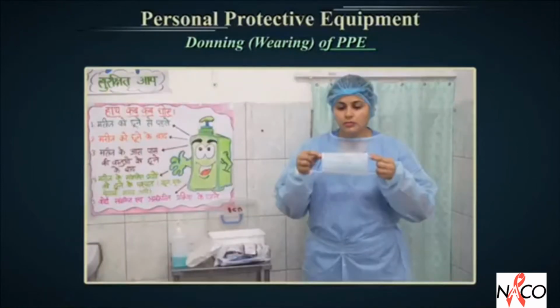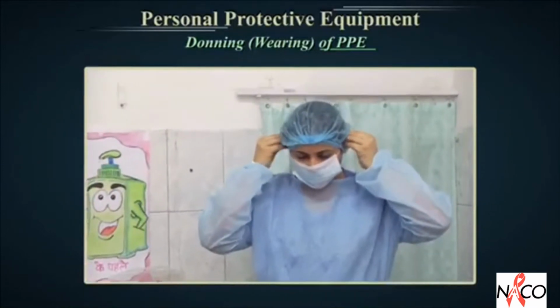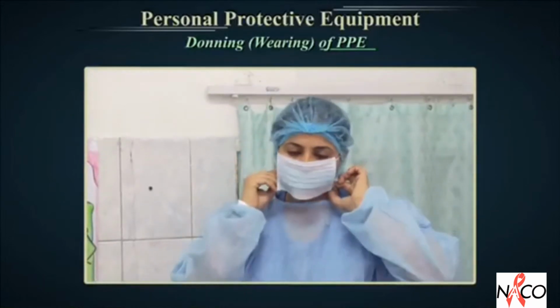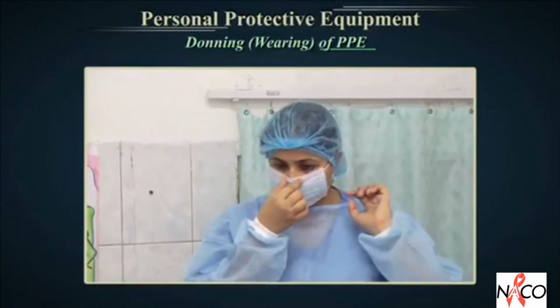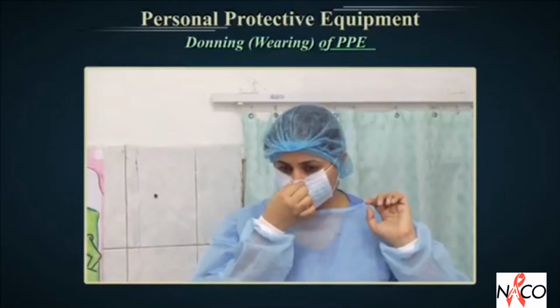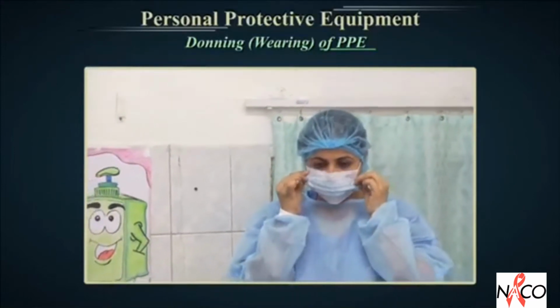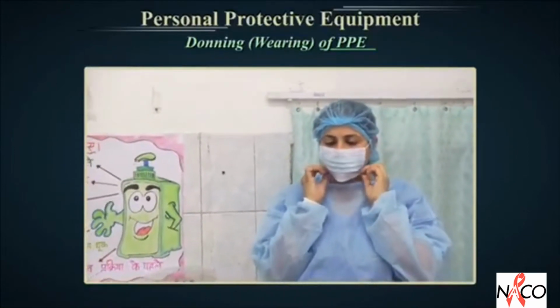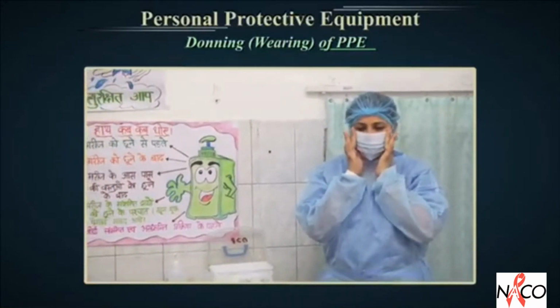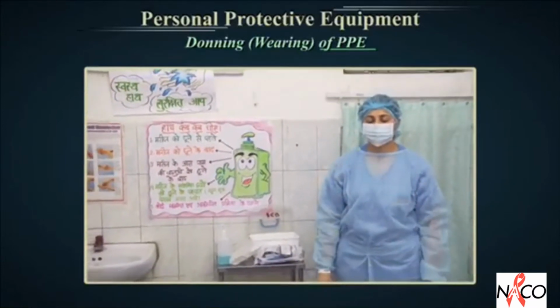The third step is providing respiratory protection. A simple way is to use a procedure mask. They are used for droplet precautions. Droplet precautions are used in the care of influenza patients. To apply this mask, gently crease the metal insert to create an indentation for your nose. Then loop the elastic bands or tying ends around your ears and spread out the mask across your face from the bridge of the nose to below your chin. Finally, ensure your mask is snug and comfortable over your face.